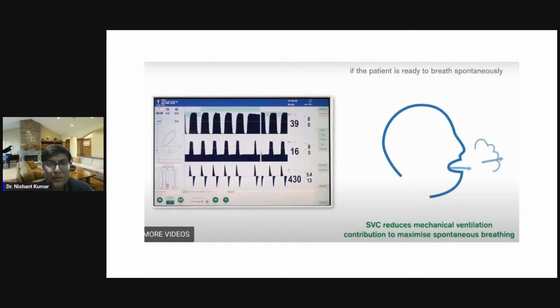Let us see here. This is the range where, in mechanical ventilation, the tidal volume, rate and pressure are set to maintain the EtCO2 in this green band. Now, from here, the patient has to start breathing on his or her own. We have reversed the neuromuscular blockade, so the green band shifts slightly higher so that respiration can be triggered.